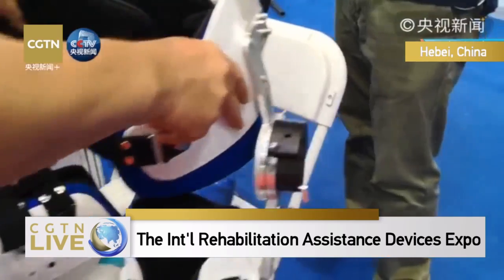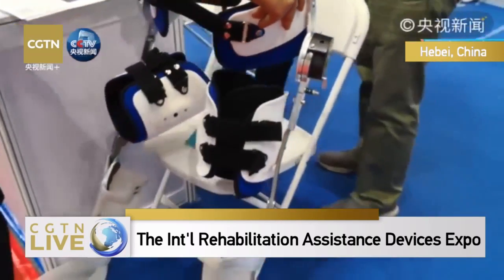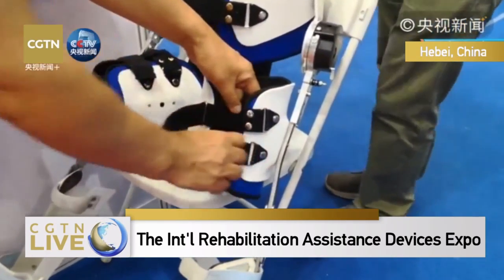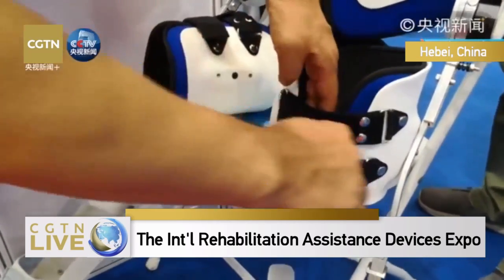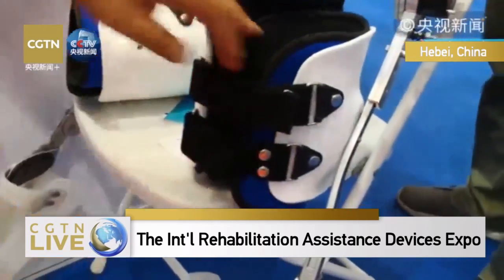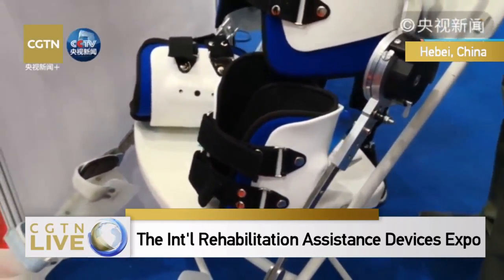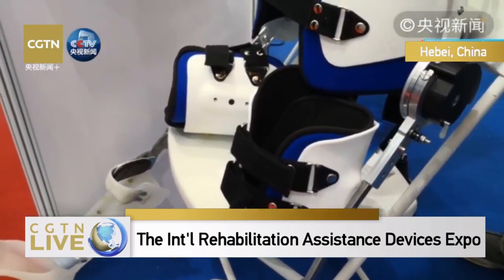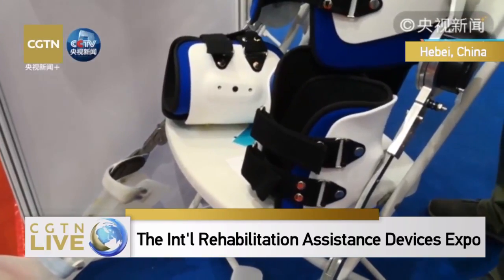And it's also very lightweight, so it will not put a lot of pressure on the patient. It can also lower the cost, and it's facing bigger market opportunities because the cost of manufacture is much lower than those with external power.